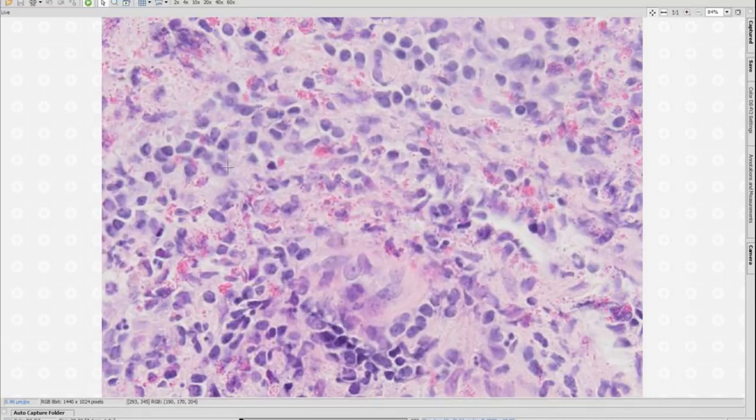And sometimes, of course, here the background is very telling. This one was also Langerhans and CD1A positive. It's a very typical presentation in a young patient. It kind of involves the pituitary stalk, diabetes insipidus, part of the hypothalamus. So when you have a small crush biopsy, it is something that is very important to have in mind.